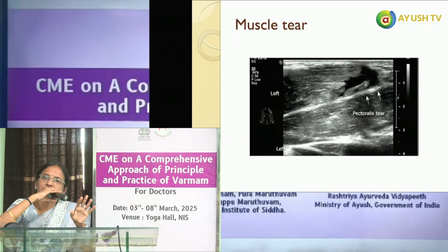ஸோ அல்ட்ராசவுண்ட்ல வந்து ஒரு மசில்ல அந்த ஏரோ பாயிண்ட் பண்ணிட்டு இருக்கிற பிளாக் ஏரியா நார்மலா இருக்கிற எக்கோஸ் கிடையாது அது மசிலோடு. ஸோ there is a collection, ஒரு ஹெமட்டோமா, ஒரு மசில் டேர் ஆகி அந்த there is a collection. இந்த மாதிரி விஷயம் any ultrasound machine you can pick up. This doesn't require a high specialist probe, high resolution probe எல்லாம் தேவையில்லை. ஸோ மசில் இன்ஜுரிஸ், மசில்ல கலெக்ஷன்ஸ், ஹெமட்டோமாஸ் அதெல்லாமே you can see it very well with an ultrasound.